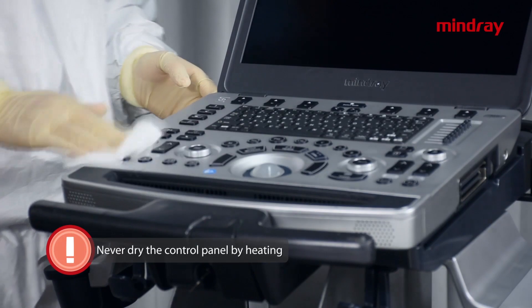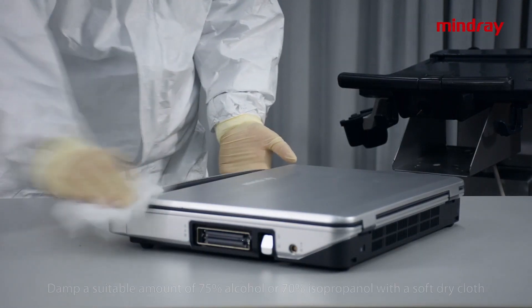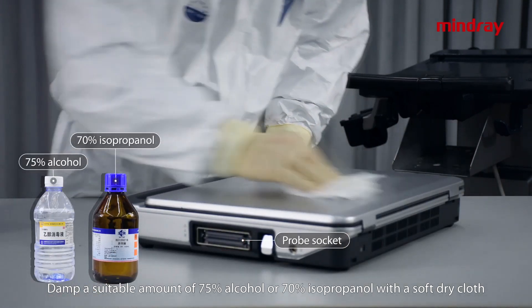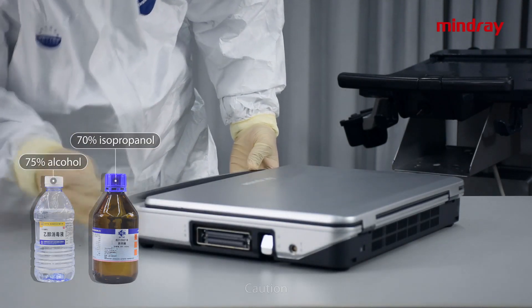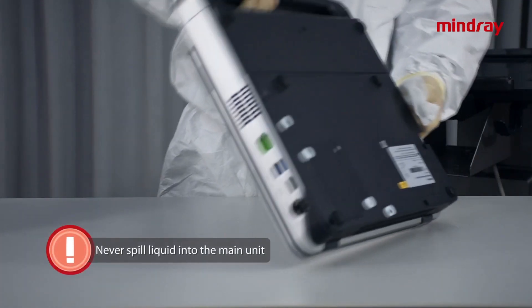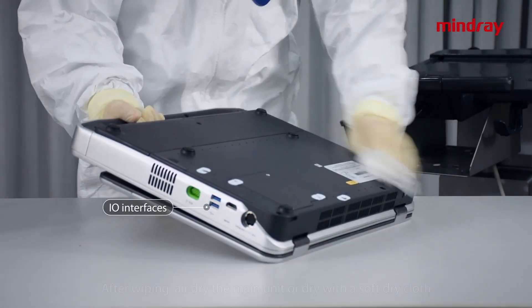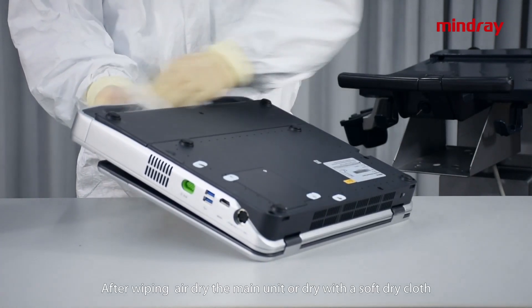Main unit disinfection: dampen a soft dry cloth with a suitable amount of 75% alcohol or 70% isopropanol and wipe the main unit for disinfection. Caution: never spill liquid into the main unit. Never use wet wipes to wipe the probe sockets and I/O interfaces. After wiping, air dry the main unit or dry with a soft dry cloth. Never dry the main unit by heating.